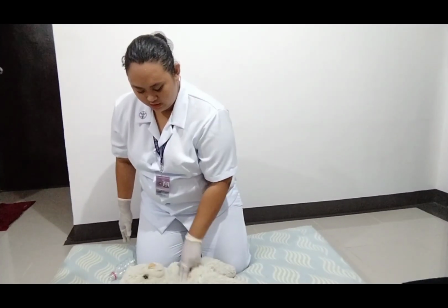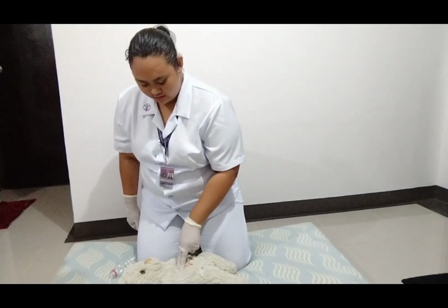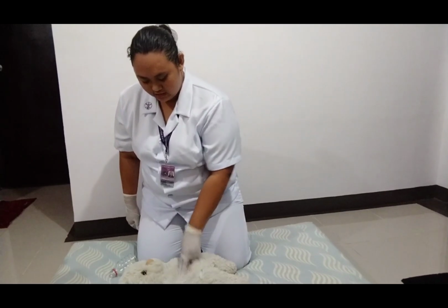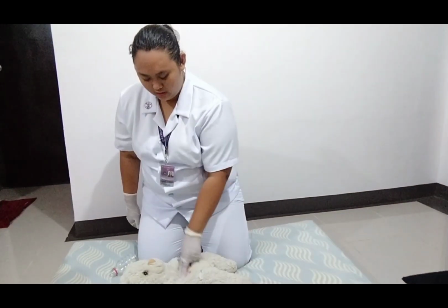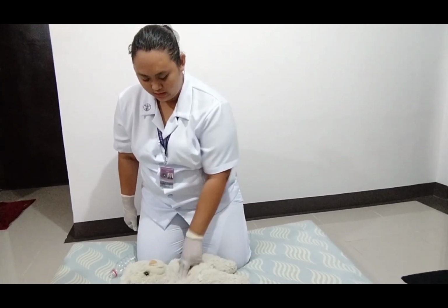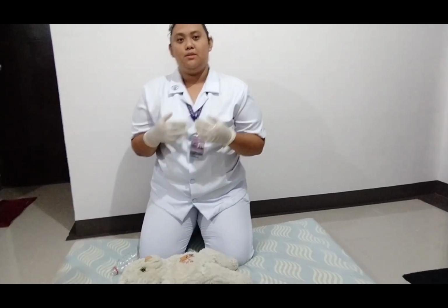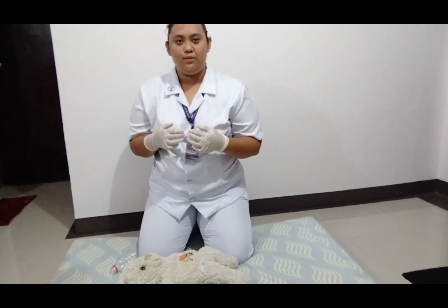1, 2, 3, 4, 5, 6, 7, 8, 9, 10, 11, 12, 13, 14, 15, 16, 17, 18, 19, 20, 21, 22, 23, 24, 25, 26, 27, 28, 29, 30. After doing that, immediately give the patient 2 rescue breaths.